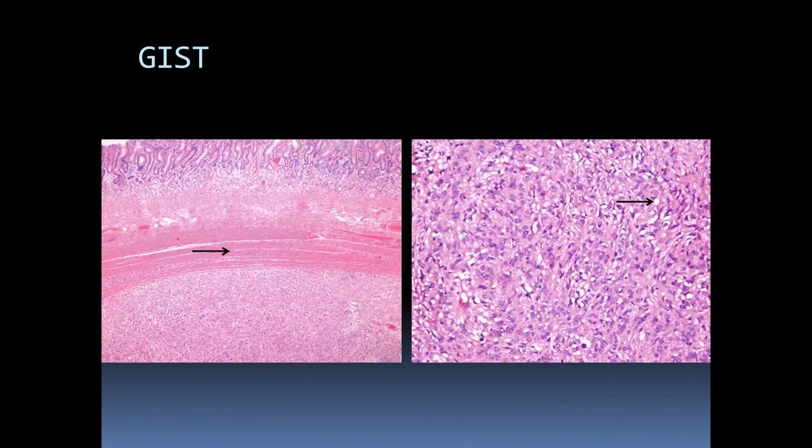One of the key things to emphasize here is that this is an intramural or originating lesion. If the lesion is centered in the submucosa, you better think twice before you call it a GIST. If the lesion is centered on the adventitia, same thing. But if it seems to be centered within the muscularis propria, odds are it's a GI stromal tumor.